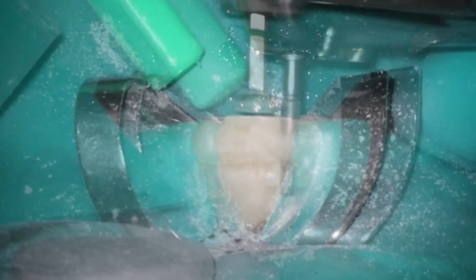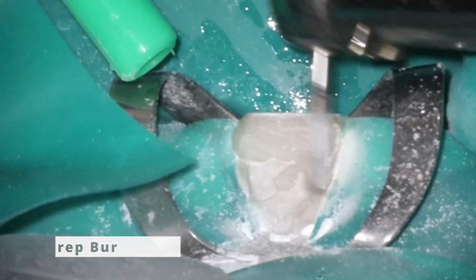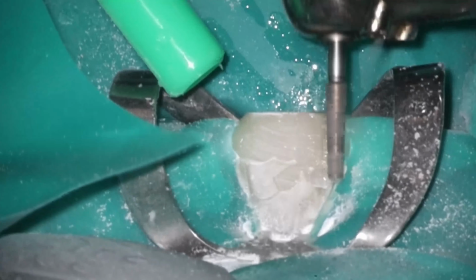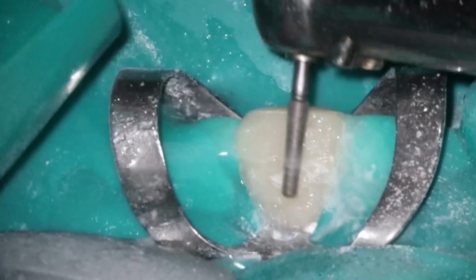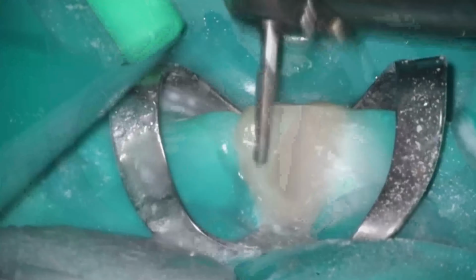First thing as always when prepping teeth is just take it out of the bite just a little bit there, or at least get the incisal edge. I'm just cleaning off a little bit here. We do most of the finishing here inside the actual mouth, but you can see where that transition line is. It looks like one piece of composite, and that's what we want to see here. And then while we're in here, I'll also start to shape the cingulum as well.